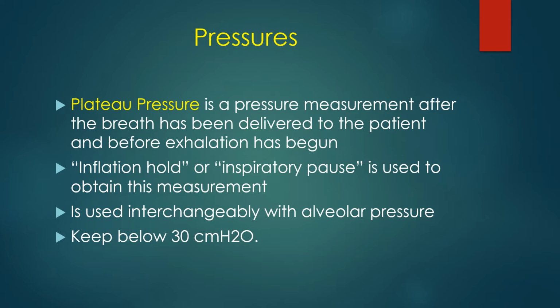The plateau pressure is something you should be measuring every time you go in and check your ventilator. One thing you want to see is if it's trending upward or downward. If every time you go in the plateau pressure is higher and higher, that could indicate something is going on with his airway or his fluid balance.